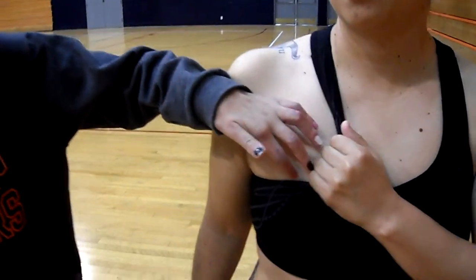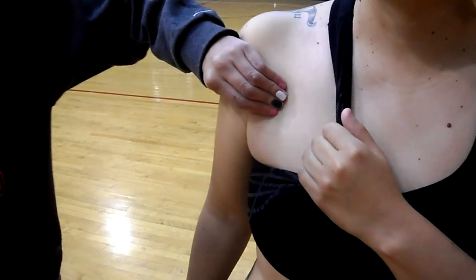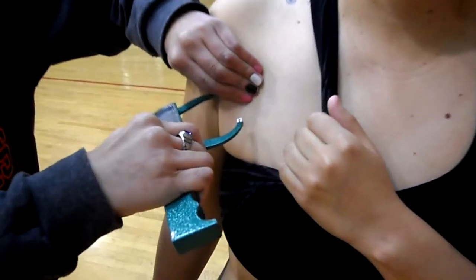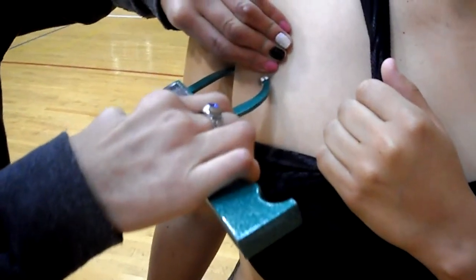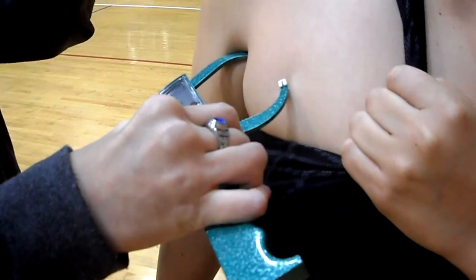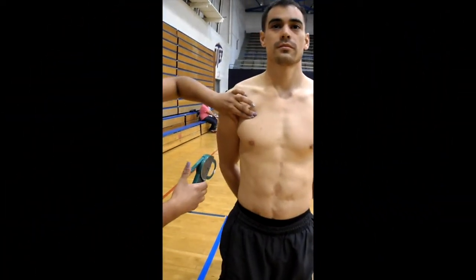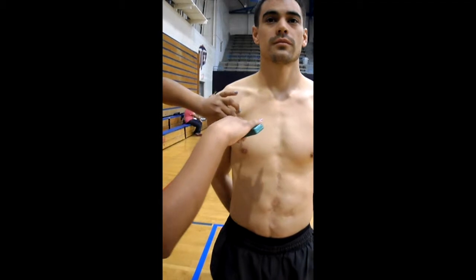Moving on to our diagonal folds, the first one is the chest. This does vary for men and women. For women, this measurement should be taken one-third the distance between the anterior axillary line and the nipple. For men, the measurement should be one-half the distance from the anterior axillary line and the nipple.